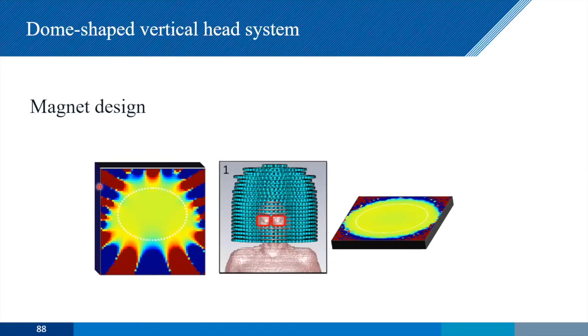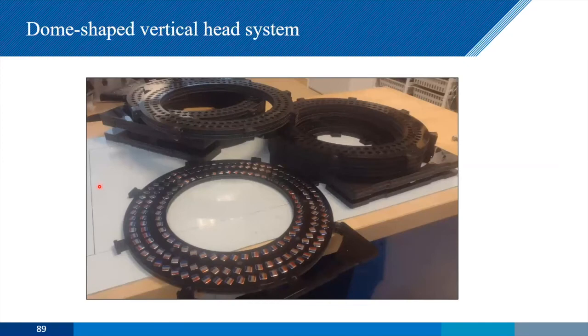We're looking at lots of different designs here. You can actually see some magnet rings right behind me here. We're designing some dome-shaped magnets. And of course, this is very much along the lines that Patrick has done in Larry's group over there. Again, we're going to aim for a very homogeneous field.